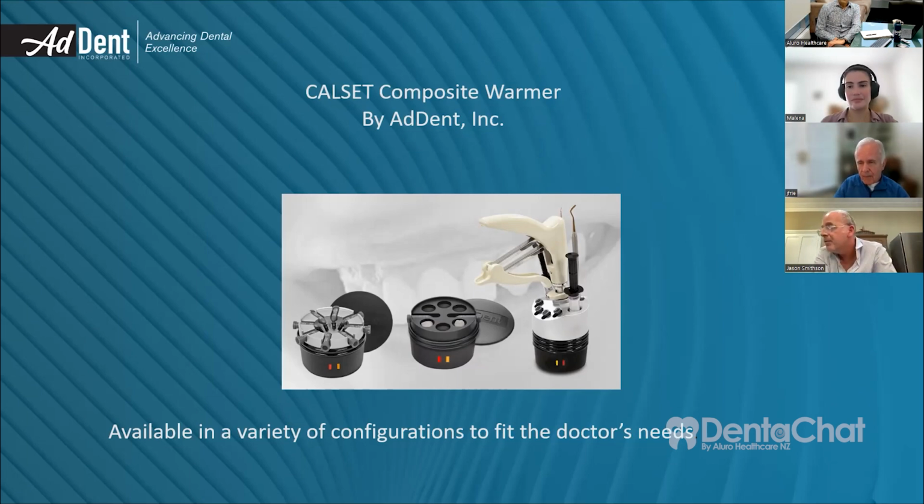From my own very not scientific anecdotal experience, I haven't noticed any particular increase in endo rates on, for example, onlays, which would be the deeper restorations I do in comparison to veneers, in onlays that are fitted with heated resin versus onlays fitted with regular veneer cement. If that was happening all over the place over the last 10 or 15 years, I would have noticed. Sure. Yeah.